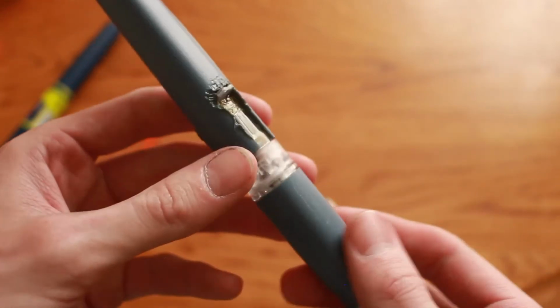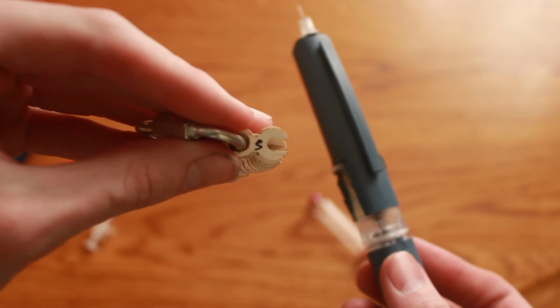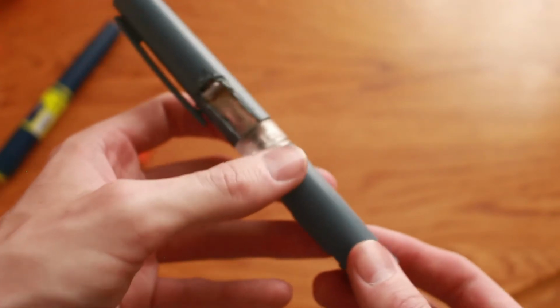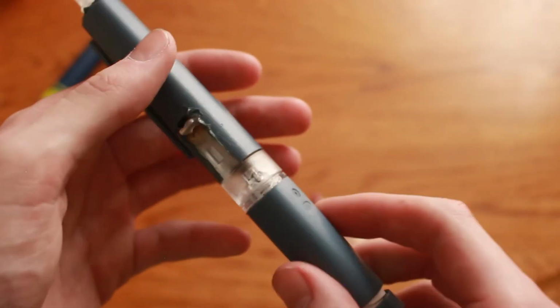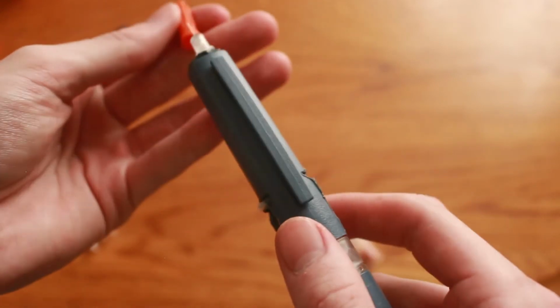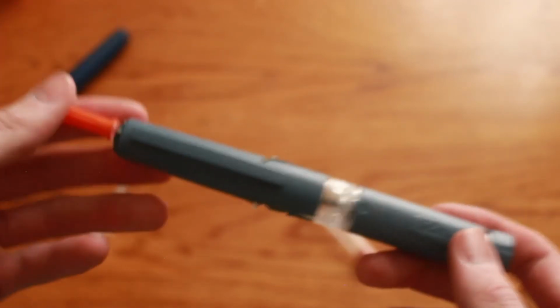If you'd like to help me turn this prototype into a finished product, just like I did with these chain links, with these little pieces of paper, I would like to try to do a precision laser cutting job on this cap and on this clear part, and maybe I can make something that looks really nice, that is very easy to use, even nicer looking than this is. And maybe even cut in a window here so you can see where it is in the dose. I'd like to do that, but I only have this one pen right now because I can't get any more Humalog, Lilly, or any sort of Lilly Kwikpens.